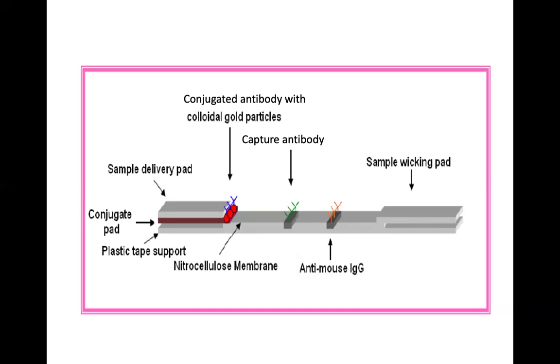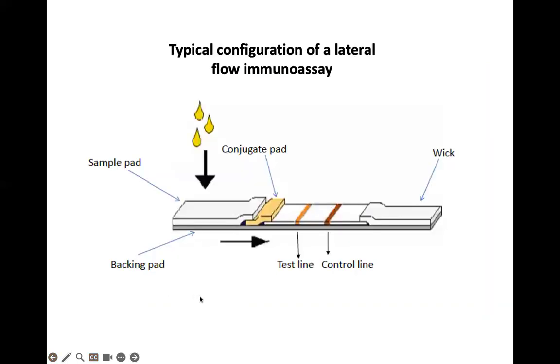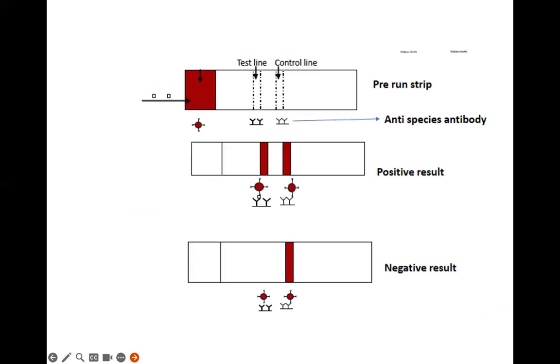No, we have to characterize the architecture, the length, and also the amount of antibody that you need to put here. Okay, so that is something that you need to remember when ordering the basic membrane or all these paddings. You have to think about exploring different types and different pore sizes. Okay. Right. I think this is the basic of what is happening.